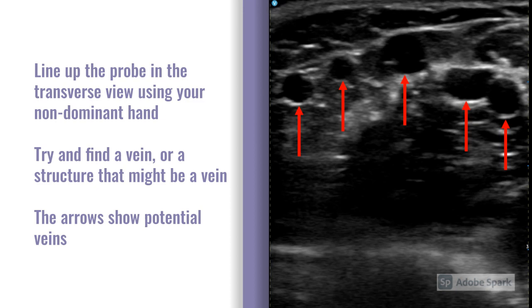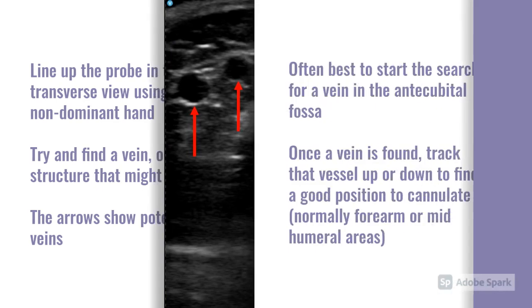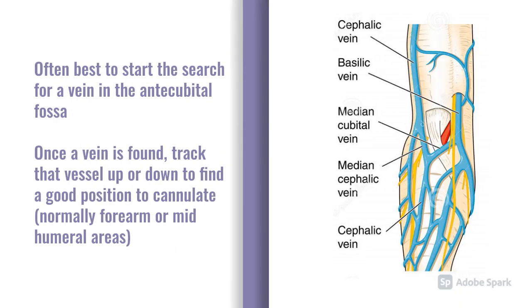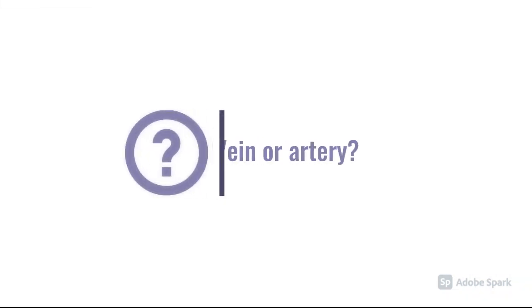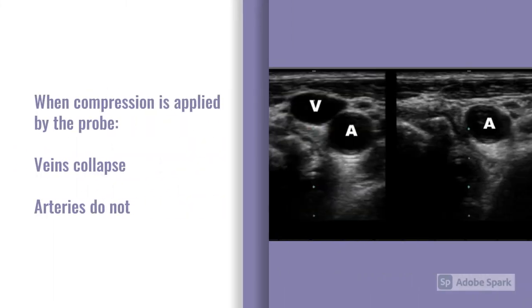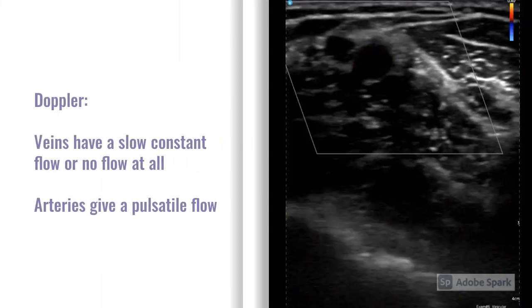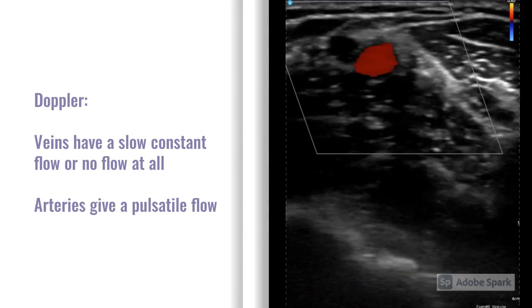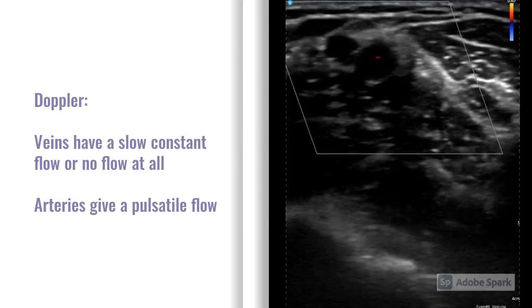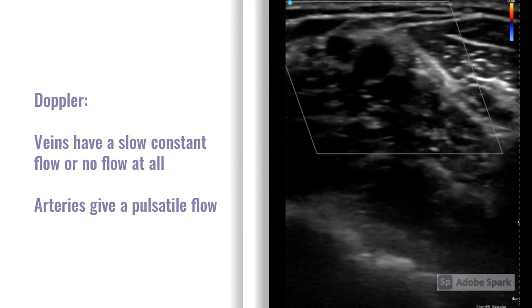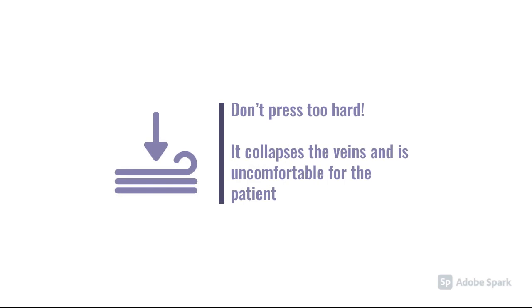We generally start in the antecubital fossa, but any suitable vein is satisfactory. You can find deeper veins there and track up into the humerus area or down into the forearm. If access has to be in a slightly atypical position, any access is better than none. To distinguish a vein from an artery: veins will collapse when you apply pressure, whereas arteries won't. Alternatively, use the Doppler — veins have little to no flow, whereas arteries have a pulsatile flow that's easy to distinguish, which is especially useful for smaller, deeper arteries. Avoid pressing too hard as it's uncomfortable and will collapse the target vein.